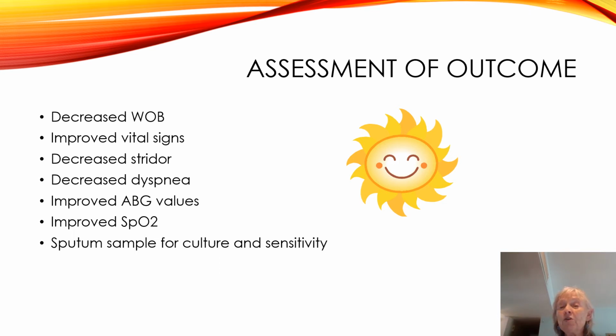And then we need to make sure that we talk to these patients. We need to ask them basic questions. How are you feeling? Have you ever done this before? This is what we're going to do. Here's what we're expecting to happen with this. If you have a question, let me know.